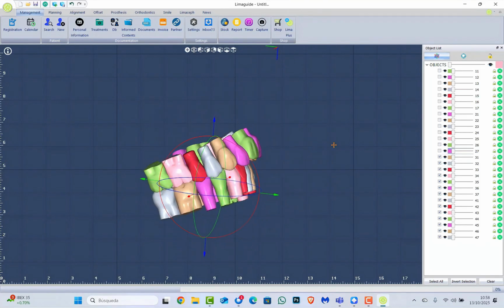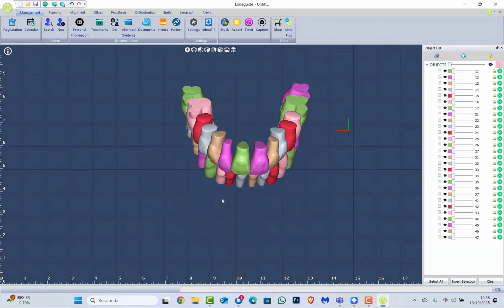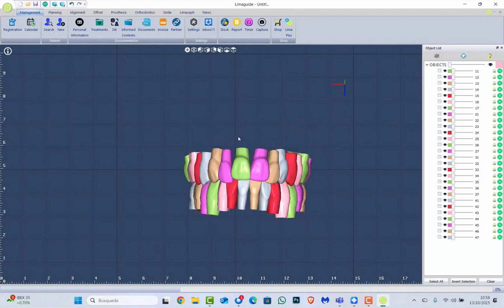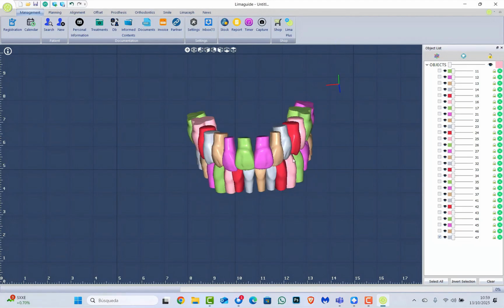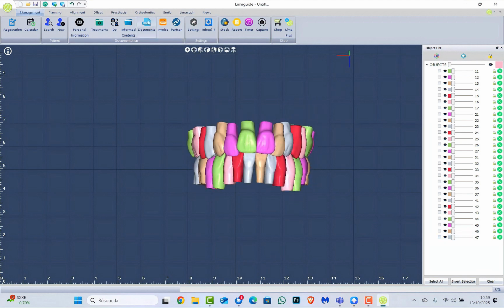Okay, so I'm going to keep them like this. Well, I'm also going to move this a little bit forward. Okay, I'm going to leave it like this. And remember, of course, that even though I was able to do all of these modifications here, it would have been better if I had already aligned them properly before importing them. So always make sure to have them properly aligned. It will save you a lot of time. Okay, so now that all is more or less aligned, I'm going to do something quite simple. I'm just going to go and click on prosthetics.